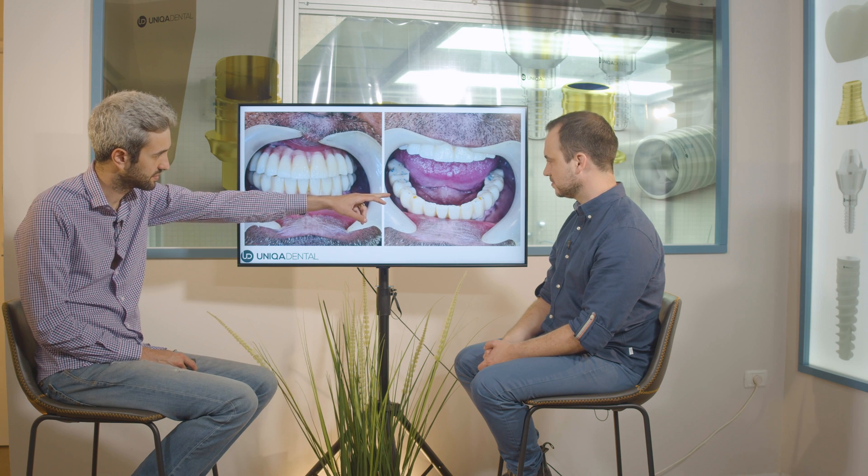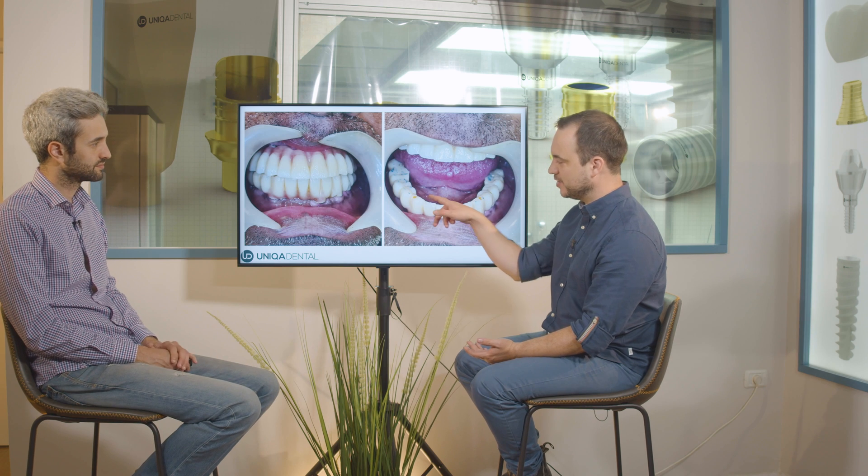You can see the occlusion is nearly perfect with contacts on most of the teeth. The screw channel on the canines needs to be closed with composite material in the color of the teeth — the patient won't want a visible yellow dot. The picture was taken before the screw channel was closed.